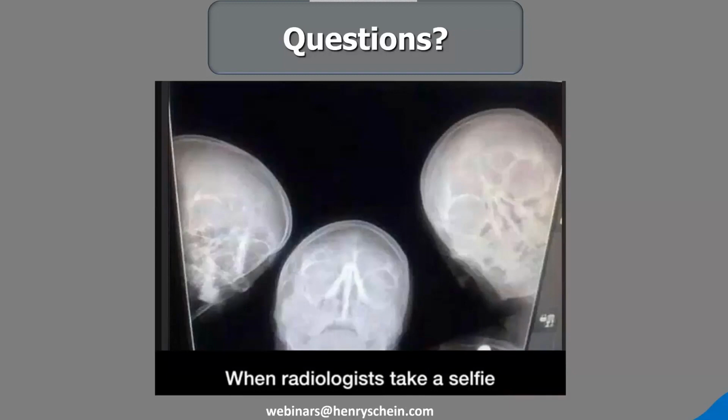I mean, can you see that there's calcifications in the neck? Yeah, we can see those. We can see if the patient has a calcified carotid atheroma. It's not too much technology because it's exactly what we need to even be able to place implants. And I would say the way that we are moving in our society, at some point, these things will become standard of care, that we will need to have 3D imaging to be able to appropriately treatment plan our patients.